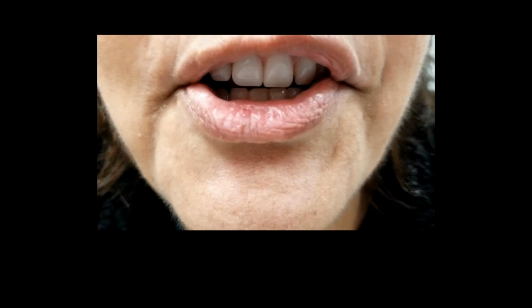Next patient walks into my office, comes in, she says, Mark, my teeth are loose. So now I want to ask them, when are they loose? Well, after I talk for a while. You have to appreciate what's happening after they talk. If they're talking, they're moving their mouth. When they move their mouth, the teeth are hitting. They can't feel them hit because there's no nerve there. And over time, it's such a slight little hit. What happens is the dentures dislodge. So I got her to say days of the week and months of the year. So I think this one she's saying days of the week.